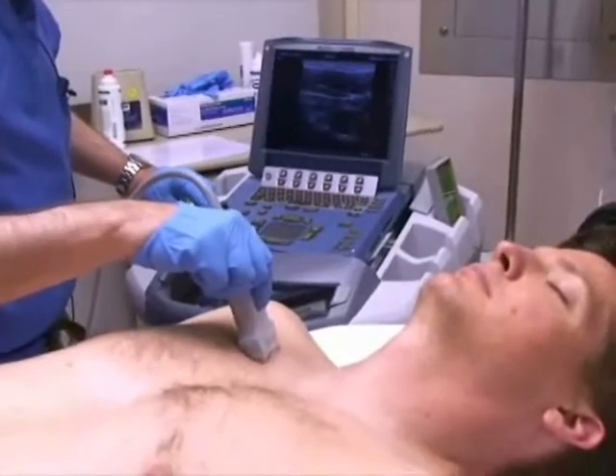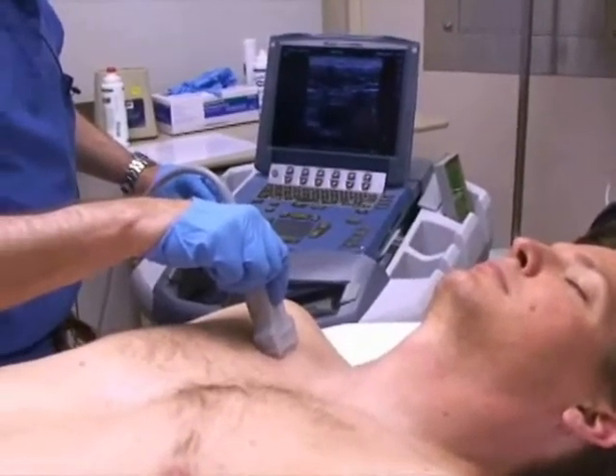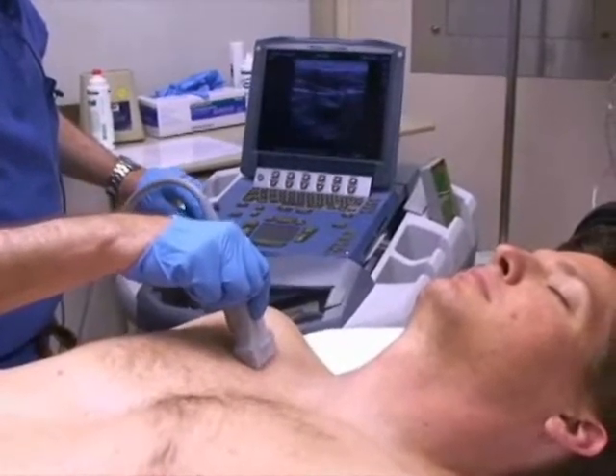On your procedure note, you must indicate that you surveyed the intended site and that the vessels were patent or not patent at that site.